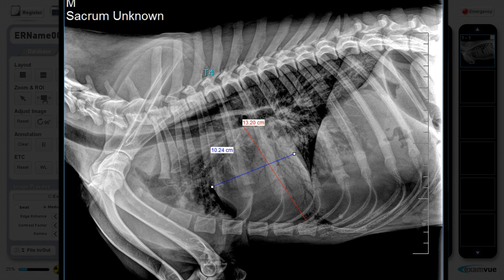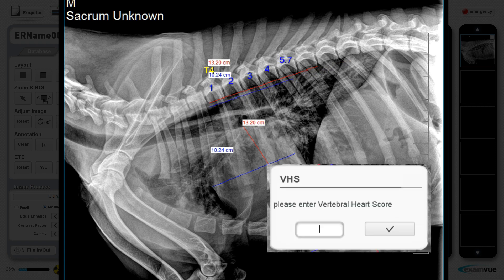Transfer this long axis measurement to the vertebrae, starting at the cranial edge of T4, and count the number of vertebrae that fall within the line measurement. Draw the fourth line to transfer the short axis measurement to the vertebrae, starting at the cranial edge of T4, and count the number of vertebrae that fall within the line measurement.